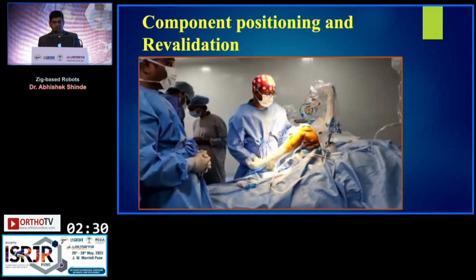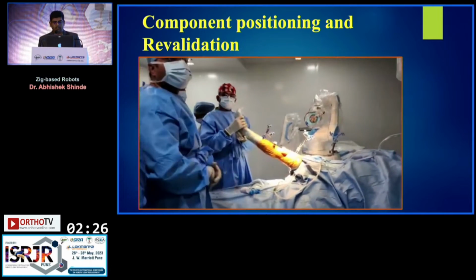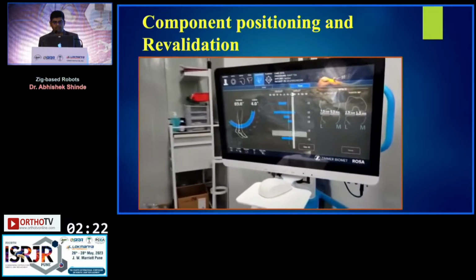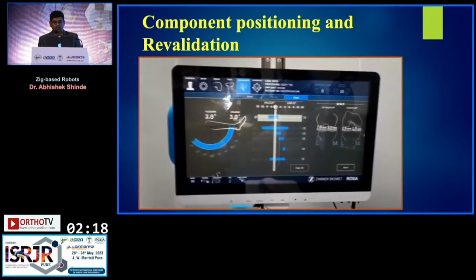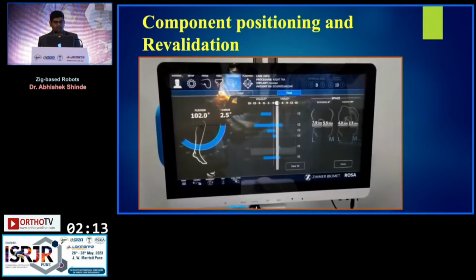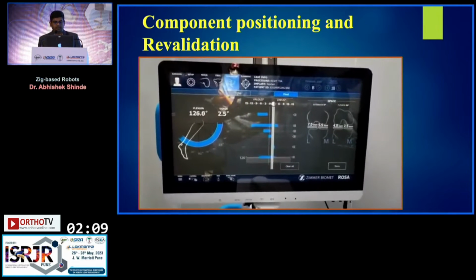So what was planned pre-operatively, or rather intraoperatively, you can check on the screen: how much correction you have achieved throughout the range of motion, and the valgus, mechanical alignment or kinematic alignment, whatever you prefer.